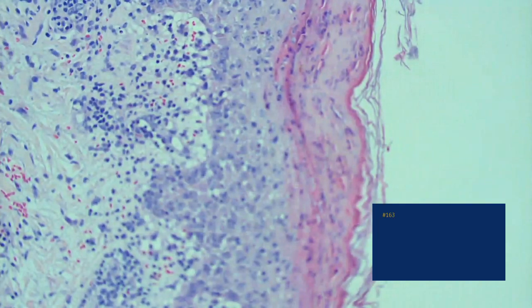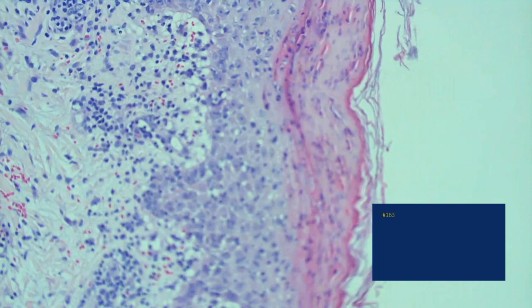So I don't like using age of lesions in the name. So we just personally would like to just call this Pityriasis lichenoides, because I don't know if this is an acute lesion, somebody's had the process for many years, or it may be a relatively chronic lesion in somebody that's got obvious PLEVA that's been present for a couple of months. So it's a beautiful example of that because it demonstrates all of the features that we just mentioned a minute ago.